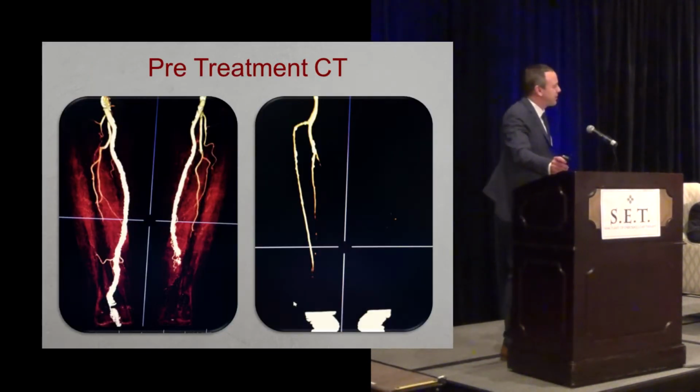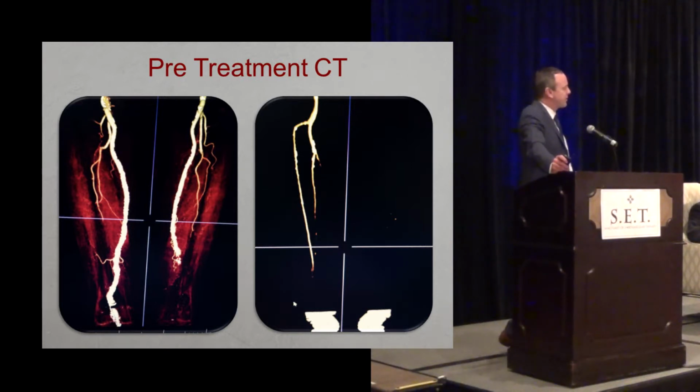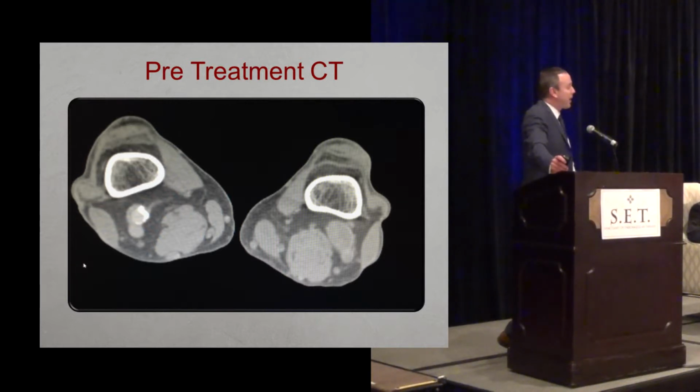This is the last patient. This is sort of the dreaded complication of anyone who has to treat critical limb ischemia, but this is a thrombosed popliteal artery aneurysm presented with a CT scan there. You can see the aneurysm. He's got rest pain, he's got foot drop, and he's sort of an emergent case.